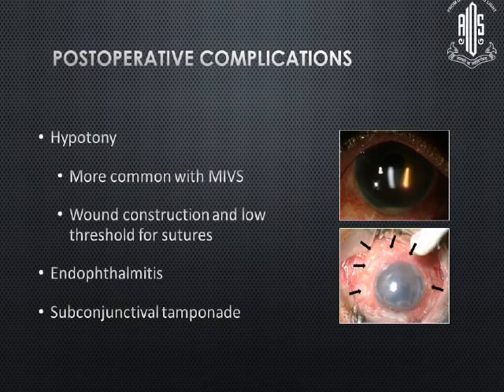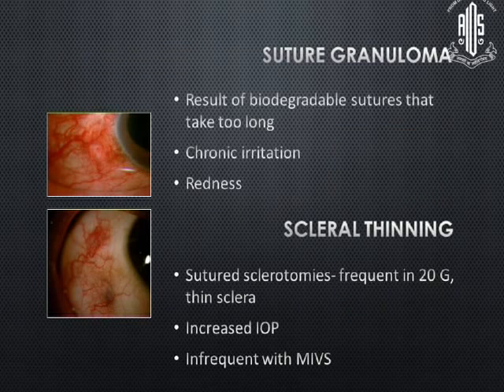So if at the end of surgery there is even a minor leakage of oil from your sclerotomy, it is better to suture the sclerotomy. Now, suture granuloma, all of us have seen it. It is the result of biodegradable sutures that take too long. Vicryl takes about 8 weeks to dissolve. So by that time, you have continuous inflammation going on. It's a minor irritant, does not affect the outcome of your retinal surgery, but definitely disturbs the patient.